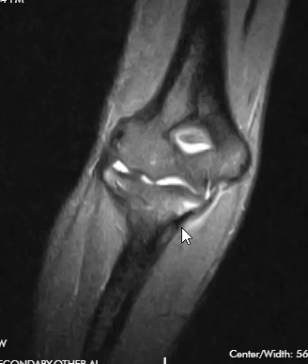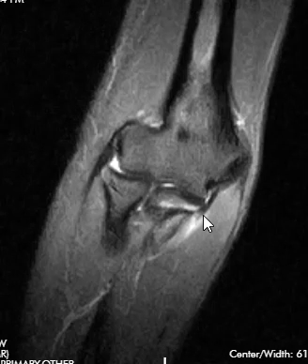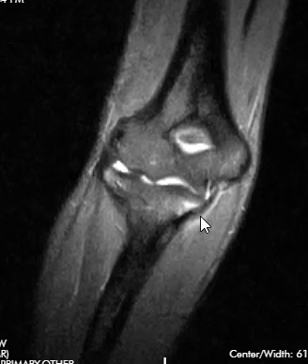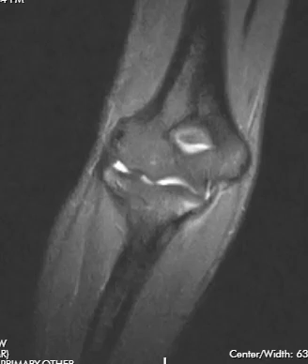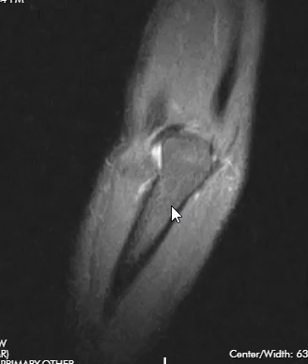This additional sequence looks at the very same thing — the ulnar collateral ligament coming down, with the attachment appearing not quite normal and a little bit of edema over the edge. So that's how we look at an MRI of the elbow. Hopefully that was interesting and helpful — thank you very much for watching.